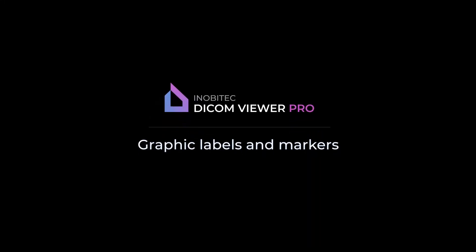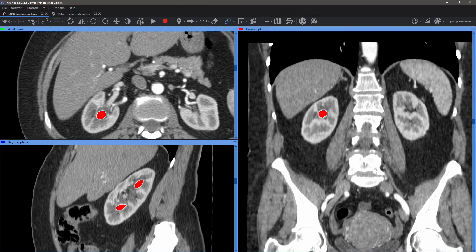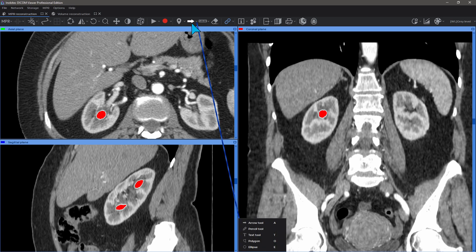Inobitech.com Viewer — graphical labels and markers. Annotation tools are available in all modes, including additional modules.